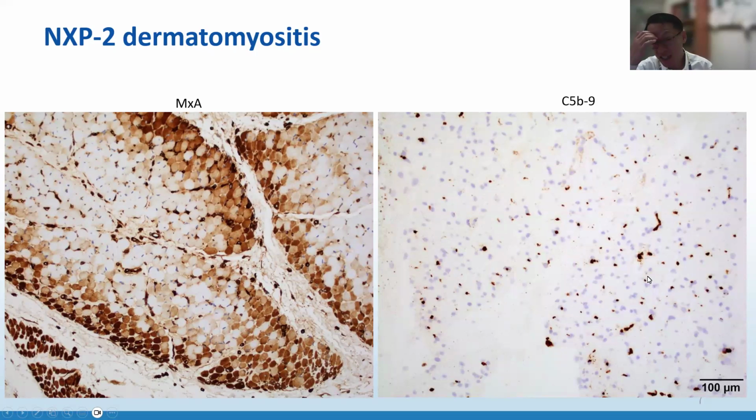This capillary staining is patchy, so it's not the same everywhere. We'll see it on the digital slides later, but when it's present, it's very robust.